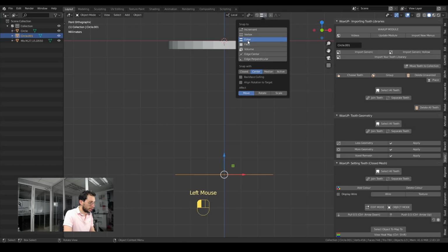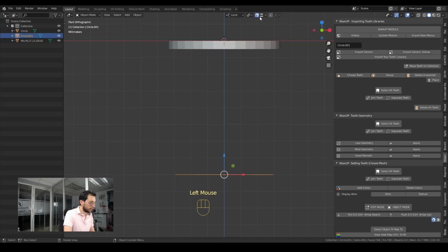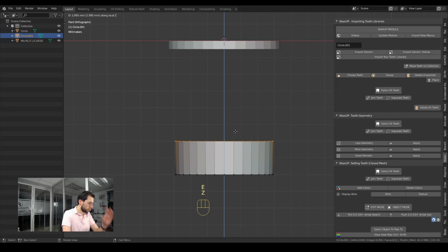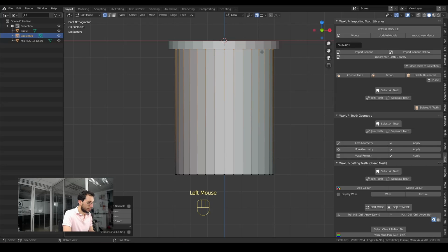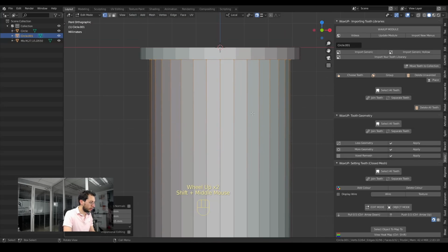So I choose here edge, and then I activate this magnet tool. I press Tab to go into edit mode, E to extrude, Z to constrain it to the Z axis. And when I get to this edge, as you can see, it snaps perfectly in place.